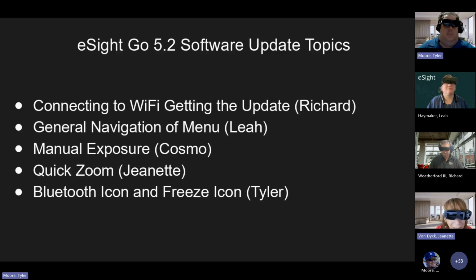So you can step up to the exact amount of zoom that you tend to like and set it so that that zoom level is what it will instantly bring you to when you press that top left-hand button. So you're zoomed out, and let's just say I like to generally be at 19 times zoom. And you suddenly press that button while you're zoomed out, it's going to zoom you in 19 times instantly. That is a really, really wonderful feature.